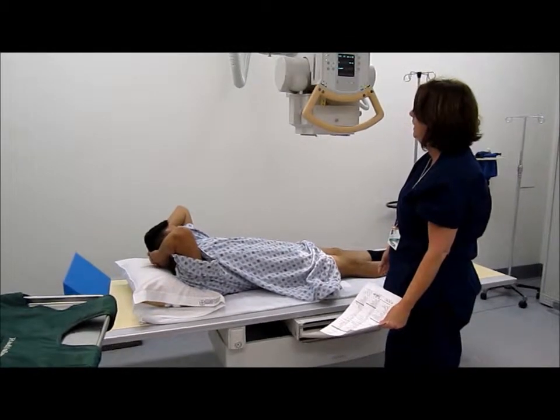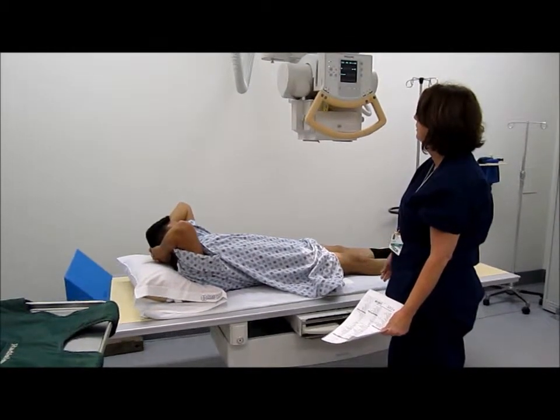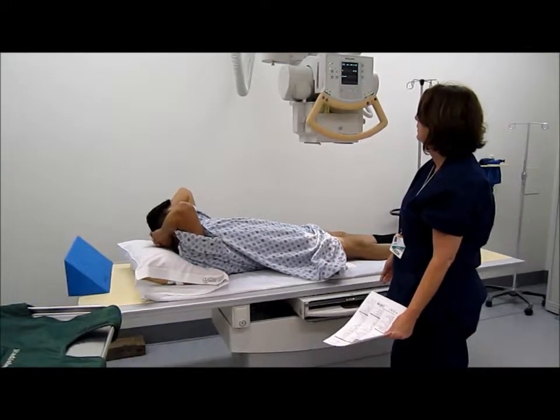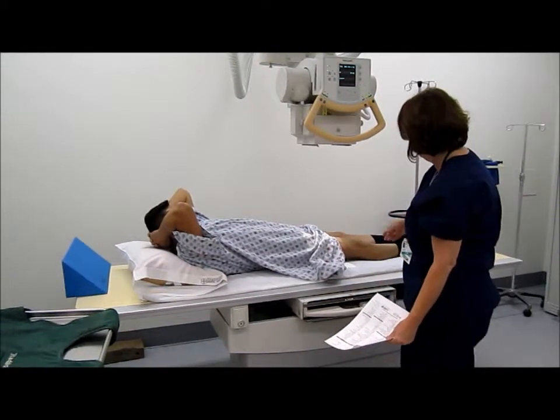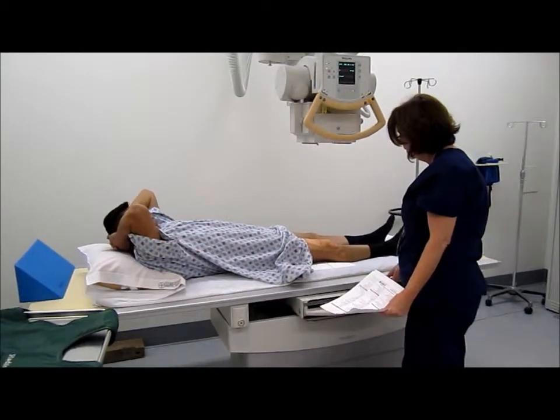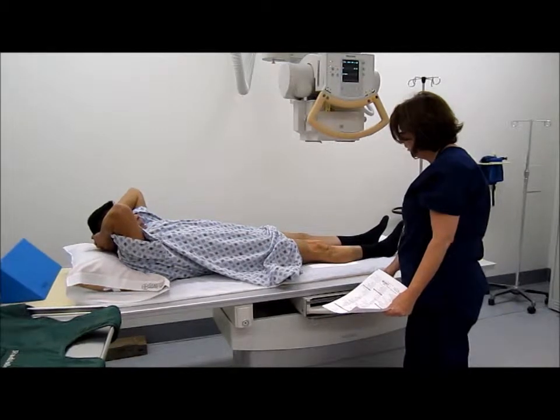Move the table to 40 inches, and center the light over the knee, half inch below the patella.